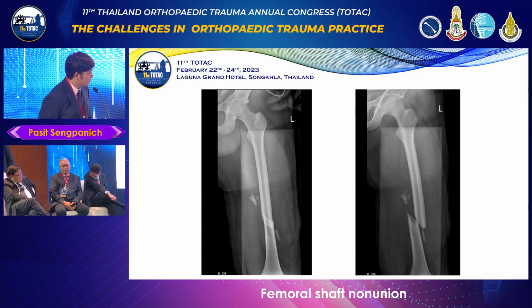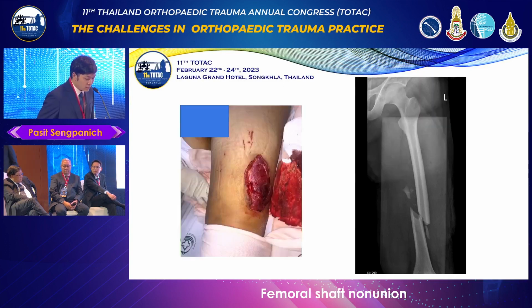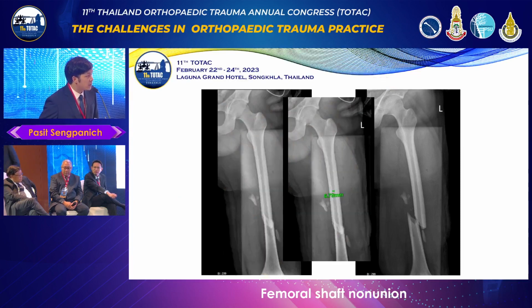And this is the film. The film shows an oblique fracture with minimal comminution at the shaft of the left femur. In this case we diagnose it as an open fracture, Gustilo-Anderson type 1. For this case, the first surgeon went to debridement and looked at the wound. The wound is good, so they decided on primary fixation with open reduction and internal fixation with a plate, due to the femoral canal being narrow.